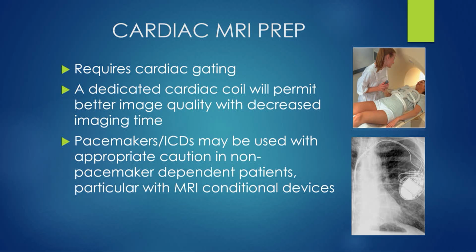You're going to need to have gating. There'll be a dedicated cardiac coil if you have a more recent MRI scanner, which will give you better image quality. One consideration, of course, is pacers and ICDs. Now, increasingly, there are MRI-tolerant ICDs and pacers. So it used to be we had a whole protocol when doing these, and we still do, but it's gotten easier.